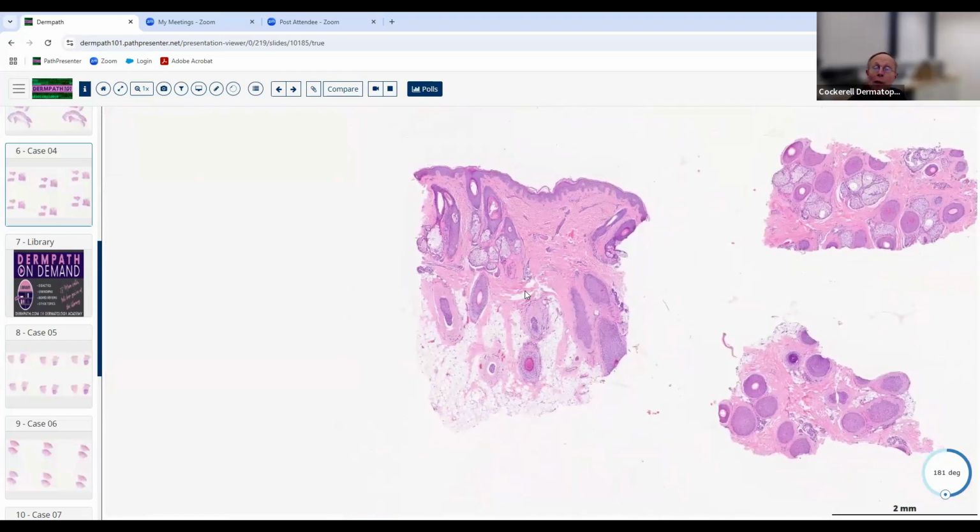So good. This is an example. We had the inflammatory alopecia before, and now we've got a non-inflammatory alopecia here, and we're able to use these other findings, the trichomalacia, the catagen follicles in different stages of evolution, to render the diagnosis of trichotillomania here. So that's great.